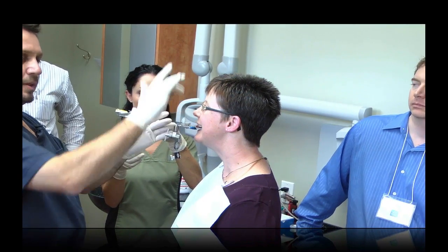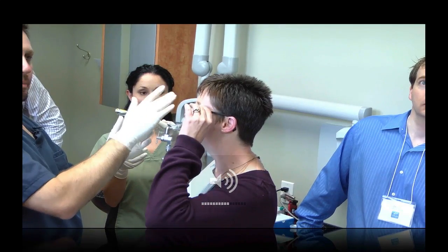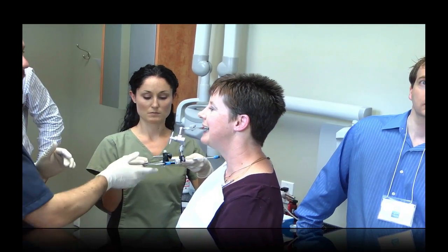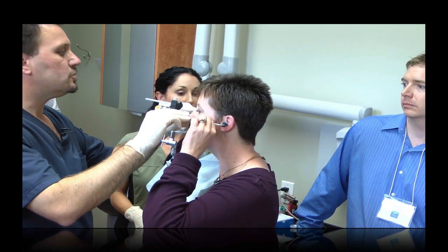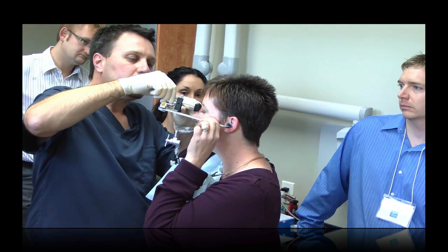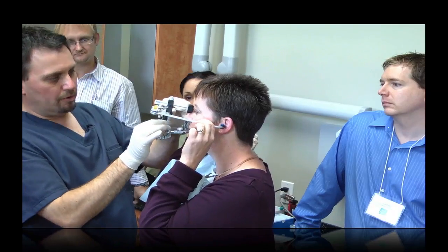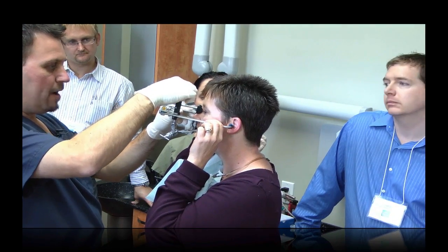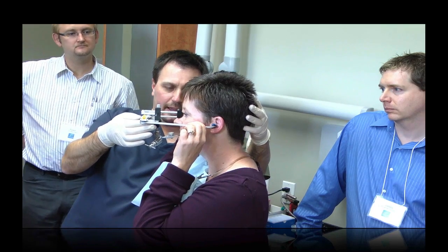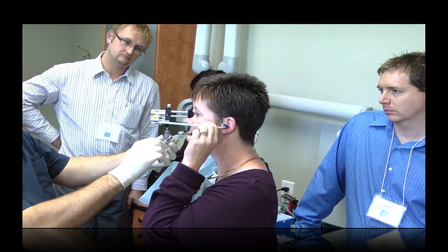I still try to get the center of the face bow in the center of their face, and then the midline will be off in the mounting. I don't center the face bow on the midline if the midline is off to one side — that way you get a more accurate face bow. Now she's going to put this in and hold it for me, and I'm just going to attach this. You rotate this over here, attach this here, tighten this — that's just this assembly. You'll be practicing on each other, so you'll get a good idea of how this works. Then I have the patient get level. And then all you have to tighten is this. So that's face bow transfer.